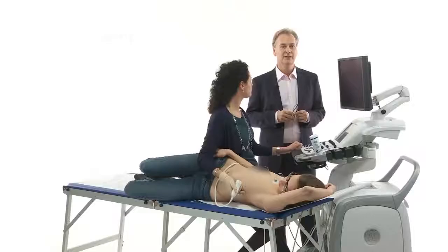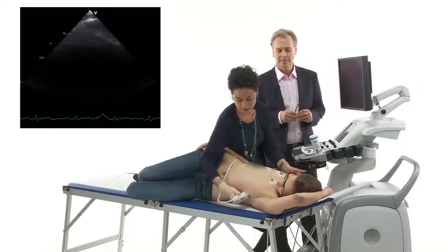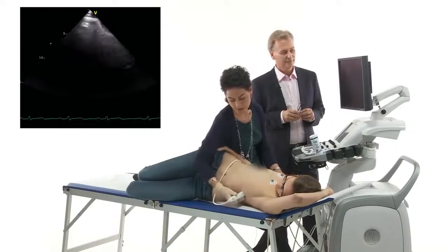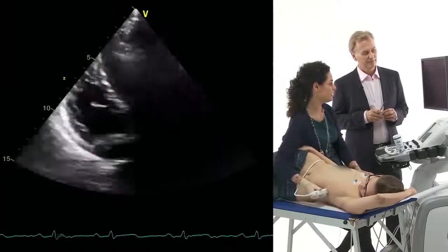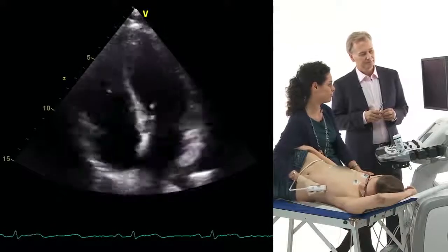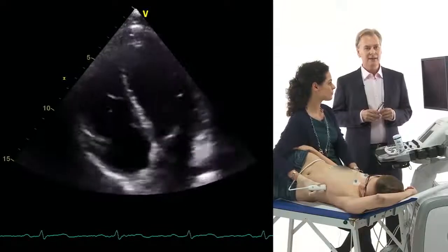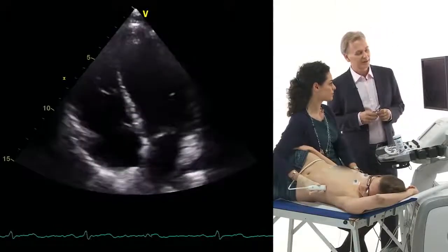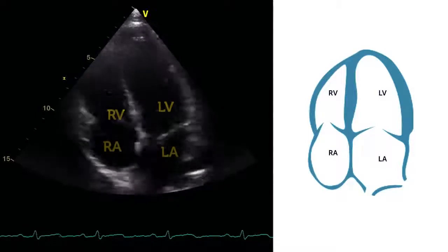The four-chamber view is probably the most important view in echocardiography — it gives us so much information. Anna, show us how to get such a four-chamber view. So my patient is almost lying on her back. I ask her just to turn a bit on her left and I put the transducer here on the fourth, fifth intercostal space. The marker is pointing really lateral and really easy — a nice four-chamber view, apical approach. This is a very nice four-chamber view. Why is it called a four-chamber view? Because you see four chambers: we have the left ventricle, the right ventricle, and both atria are visible.